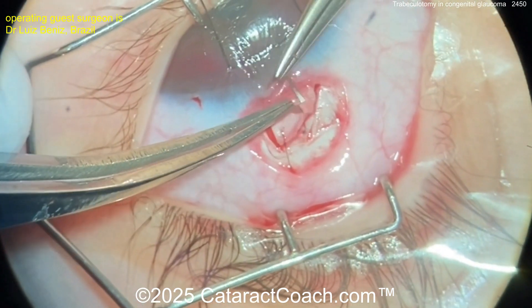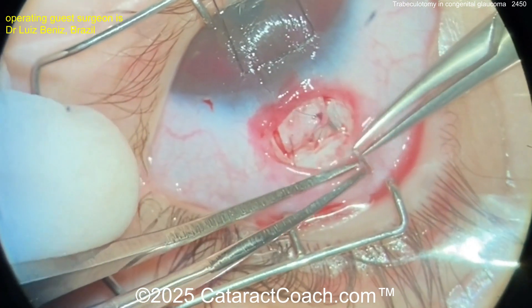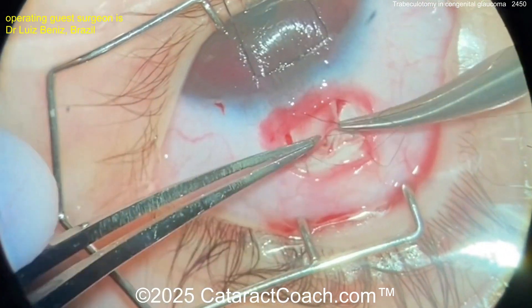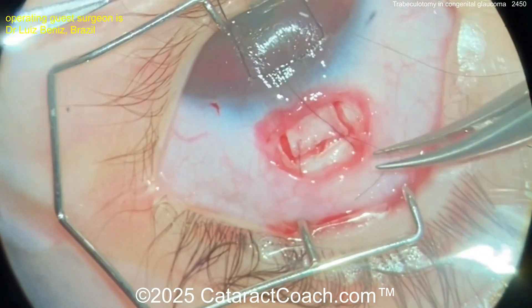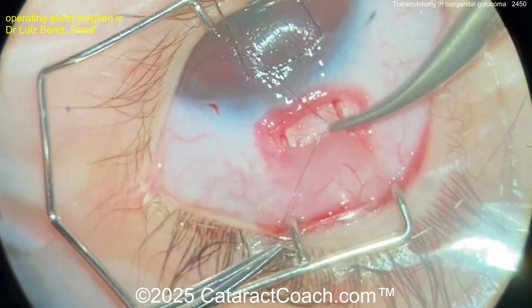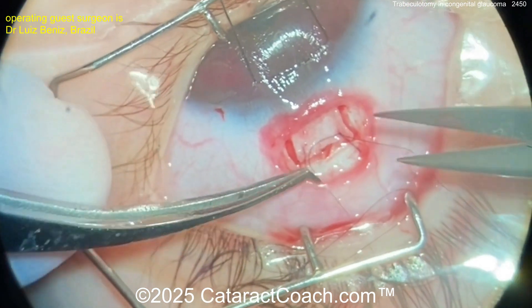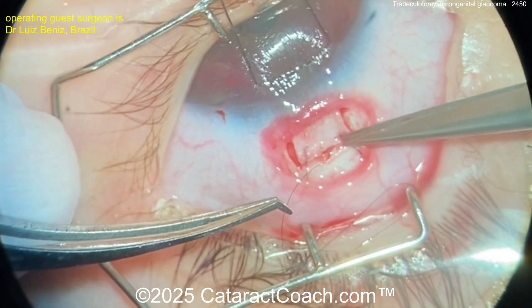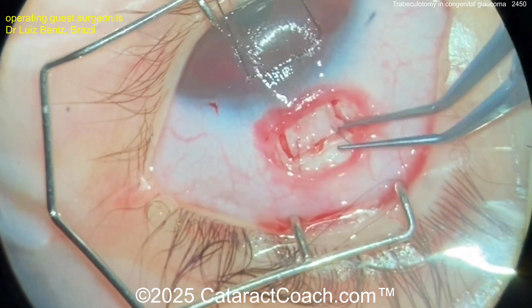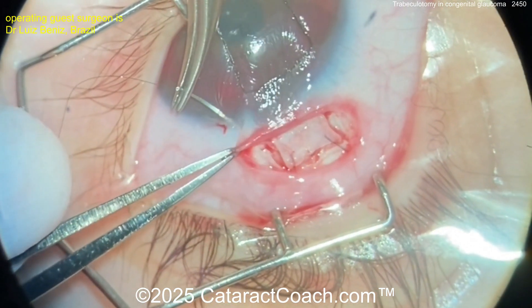That looks good on that side and on the other side as well. Remember, this is just the beginning for this patient — you're going to have to monitor very closely over the course of many years. Studies have shown variable success rates, and with time these tend not to keep working to the same degree. The reality is this patient will probably have multiple procedures in his or her lifetime. There you go — flap sutured down.